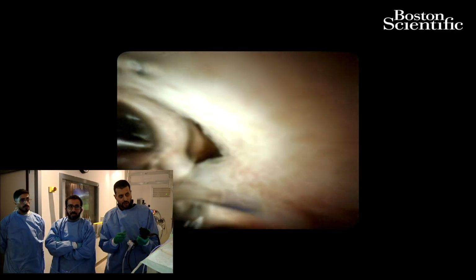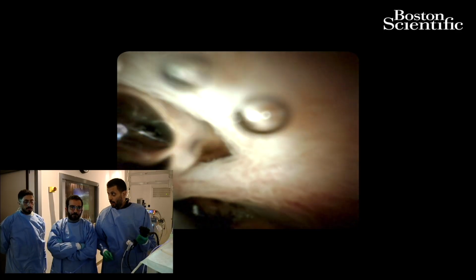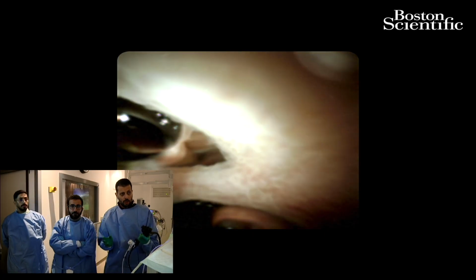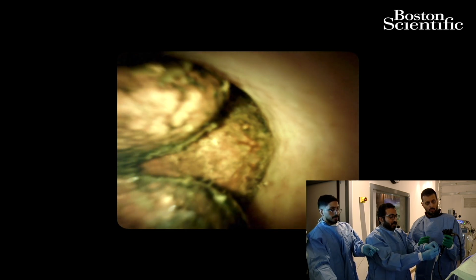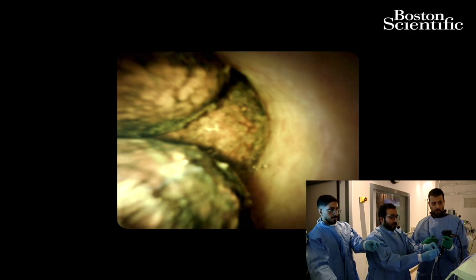So as you can see, guys, just a quick interruption. There's the cystic duct, and beneath is the common bile duct. And you can see here on fluoroscopy that's exactly the direction of the cystic duct. So it's good to know, because sometimes you are a millimeter away, and we use saline or water as the medium to conduct the shocks. That will be a little bit different. Now we are using the EHL.